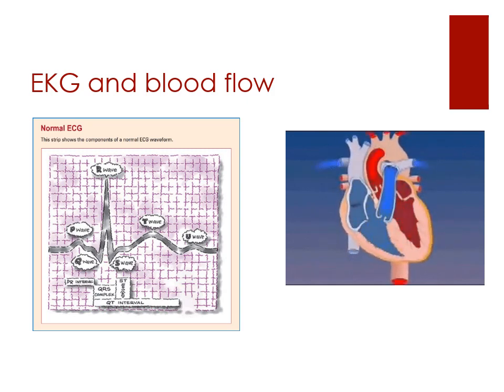You will get the U wave when you start looking at your heart diseases again next quarter, and especially in critical care. The U wave is actually in relationship to the potassium. You know how we always talk about potassium and how, if you have hypo or hyperkalemia, it causes that extra wave. That's what the U wave is, and you will learn that when you get into your higher levels of med-surg beyond us.